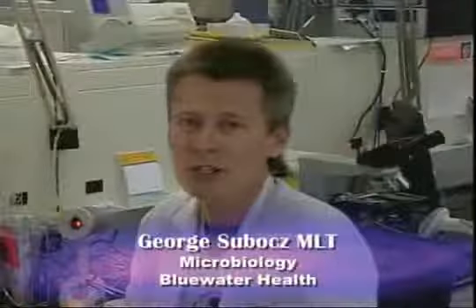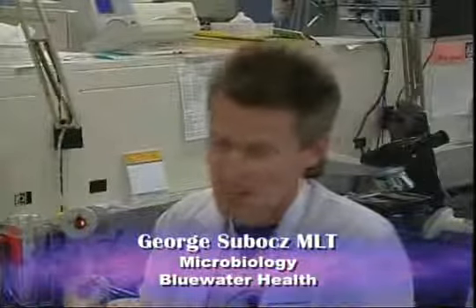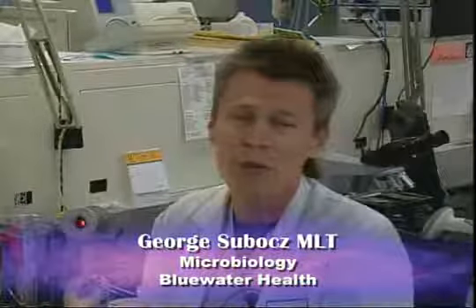Hi, my name is George. I'm a medical lab technologist who works in a hospital microbiology department. I've been asked to give you a short overview of what we do here with the specimens that you'd send down for culture.